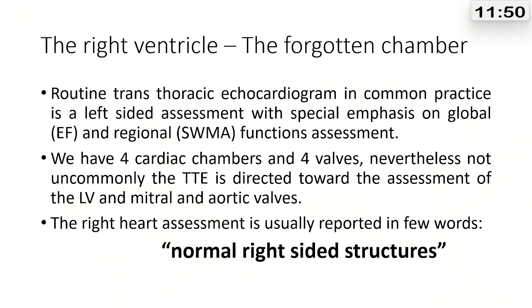The right ventricle is actually a forgotten chamber. Routine transthoracic echo in common practice is a left-sided assessment with special emphasis on global and regional function. Even the patient, after ending the exam, is asking about his ejection fraction, so it is a very well-known left-sided examination. And we have to remember that we have 4 cardiac chambers and 4 valves, and the right heart assessment is usually reported in very few words, stating normal right-sided structures.